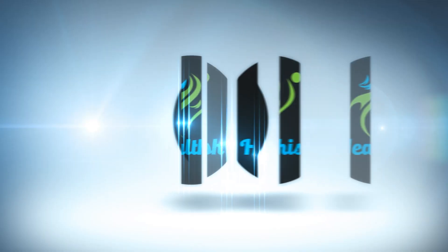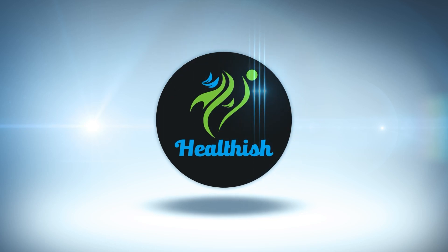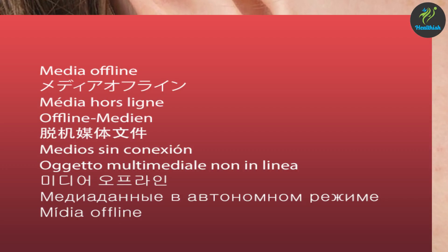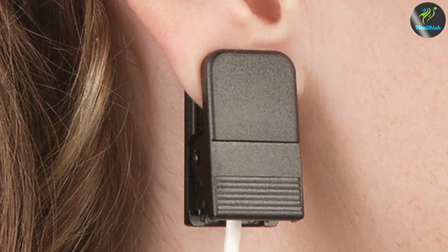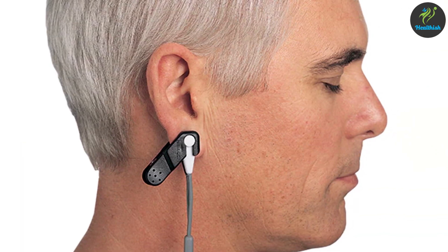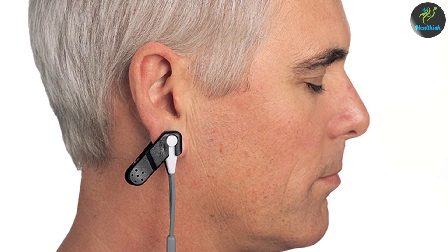Let's begin by understanding what an ear pulse oximeter is. An ear pulse oximeter is a compact device designed to clip onto the earlobe. It measures blood oxygen saturation levels and pulse rate by shining light through the earlobe and detecting the amount of light absorbed by the oxygenated and deoxygenated blood.